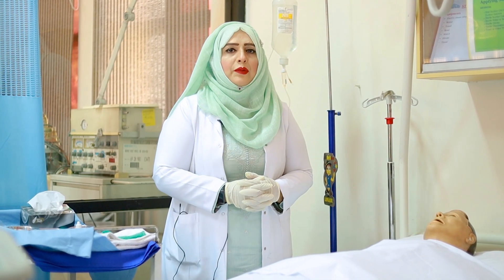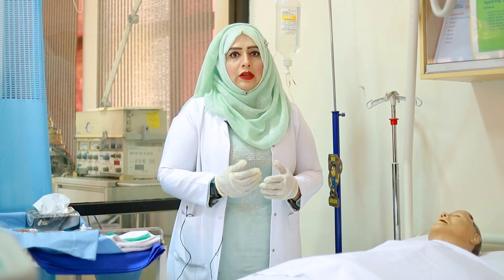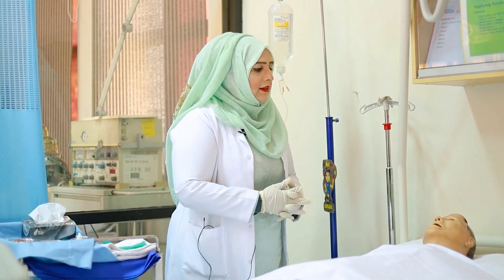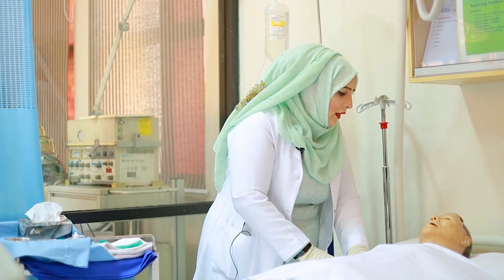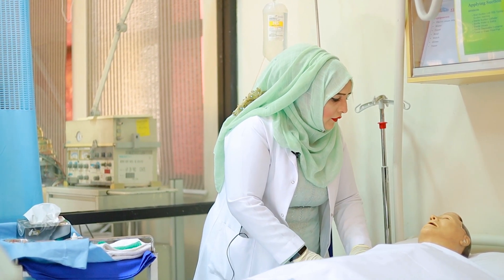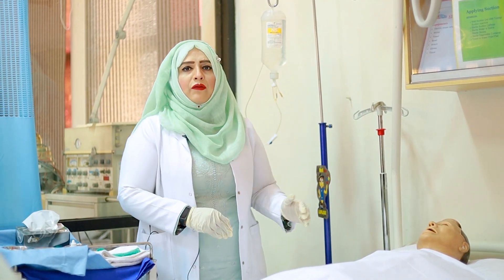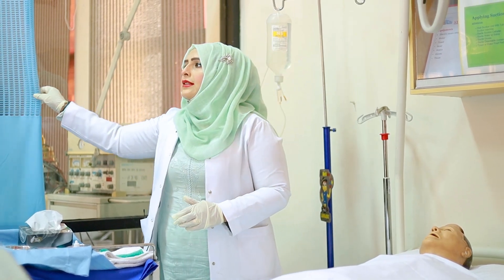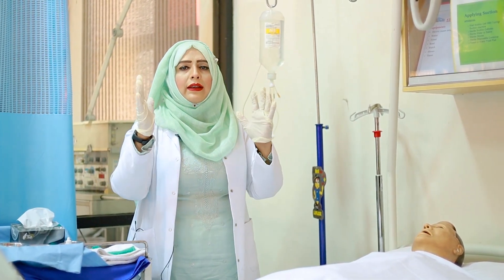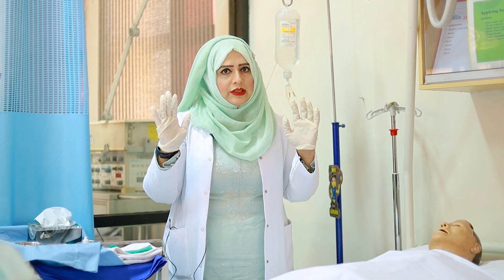Before starting the procedure, always remember there are three or four things you must know. The first thing, you must greet the client — Assalamu alaikum, Mr. Ali. I am going to irrigate your right eye. Are you with me? Are you going to give me permission? Thank you so much. So now I have got permission from the client. Then always provide privacy to the client. Hand hygiene and must wear gloves for the purpose of sterilization and patient safety.